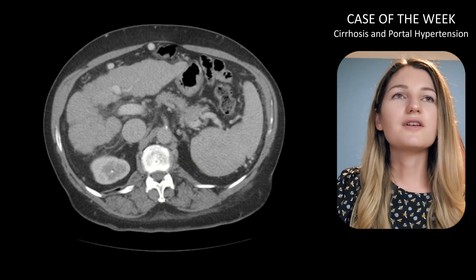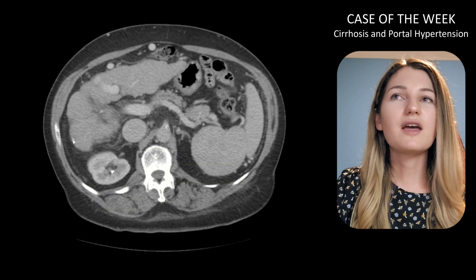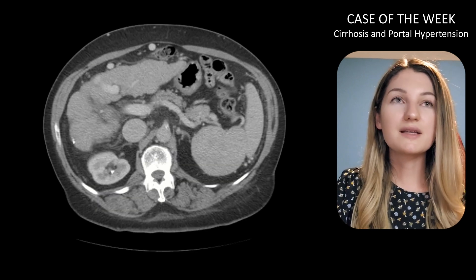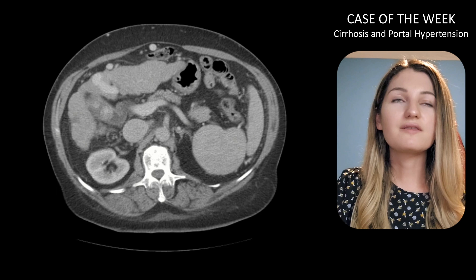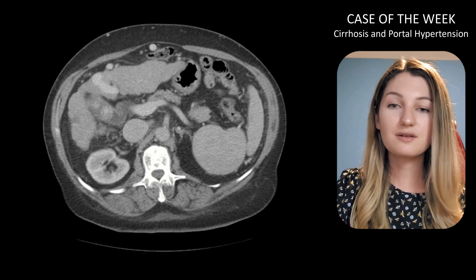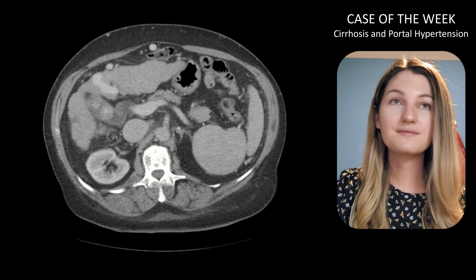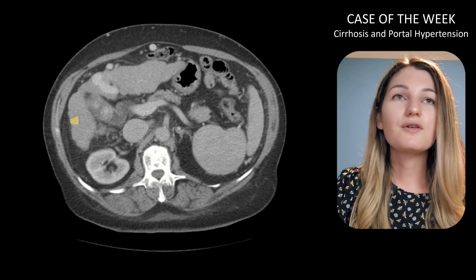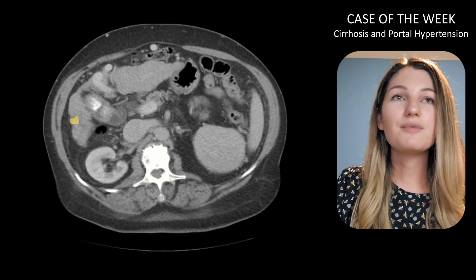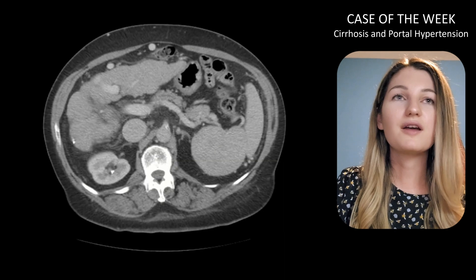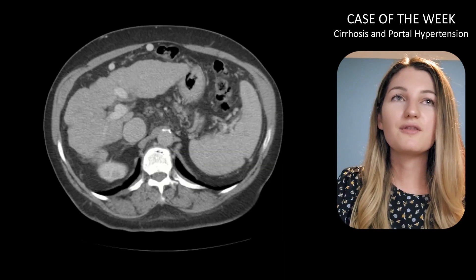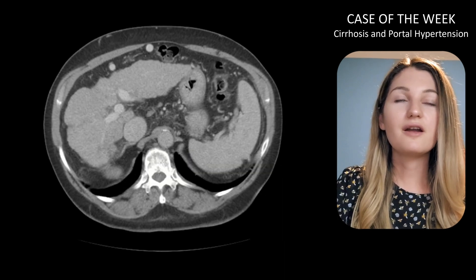First we'll scan our liver for evidence of any abnormal areas of enhancement or hepatic masses. Any mass in the cirrhotic liver should be considered hepatocellular carcinoma until proven otherwise. Luckily there are no hepatic masses here — just a focal wedge-shaped hypodensity in the periphery of the right hepatic lobe, which is just a bit of focal fibrosis, not a mass.